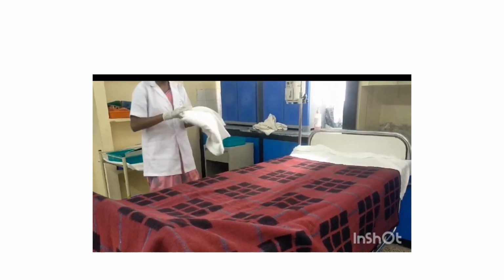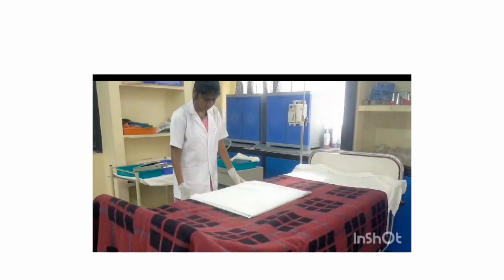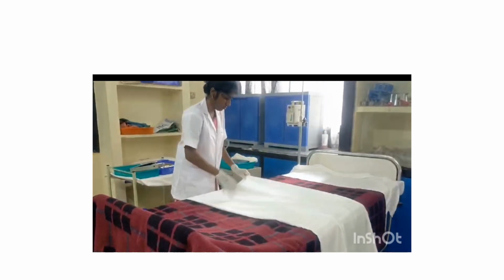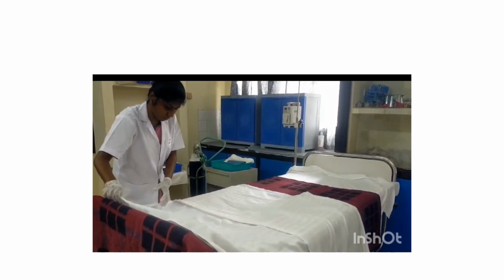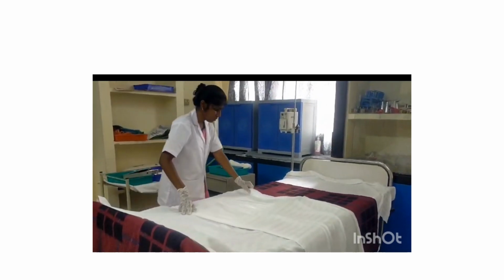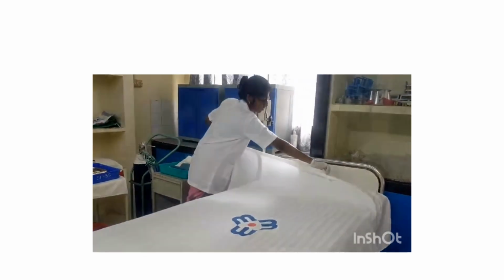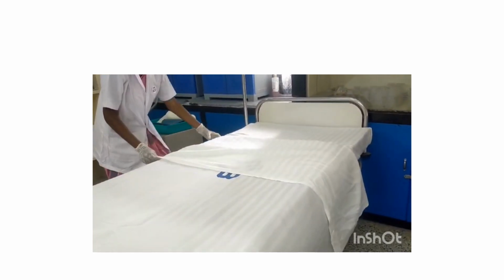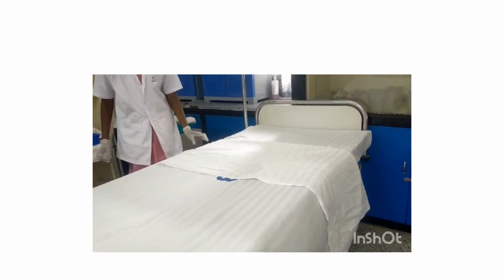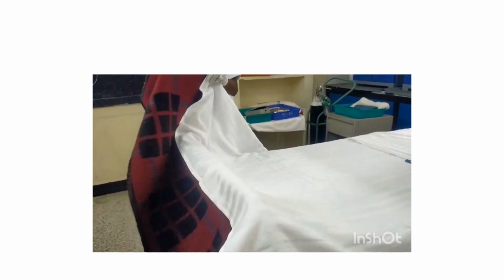Okay, now take the counter sheet and place it above the blanket. Spread it to the foot end, and next spread it to the head end. After spreading to the head end, take the counter sheet, blanket and the top sheet together and make a half fold. Then come to the foot end, take the counter sheet, blanket and the top sheet and fold it in a triangular fold.